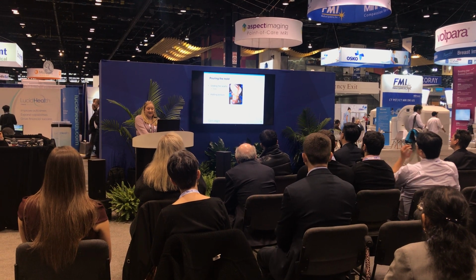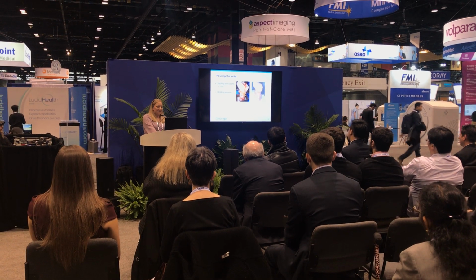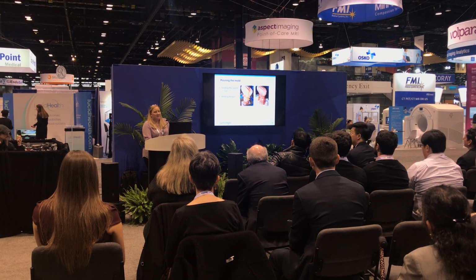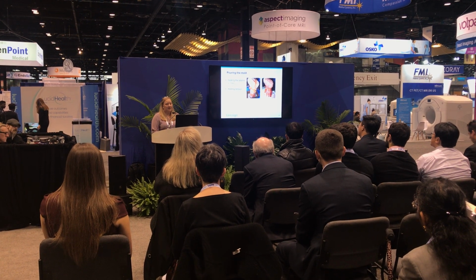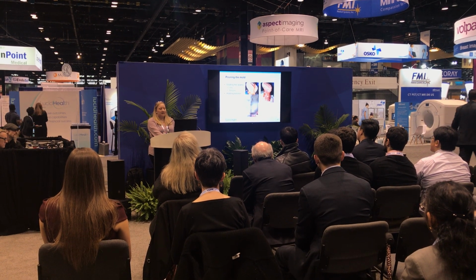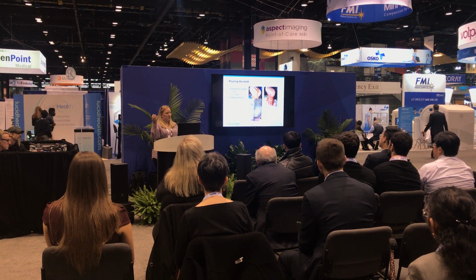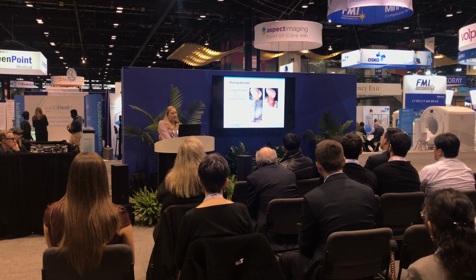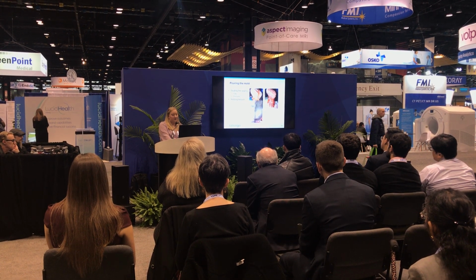So, sealing the seams. We have used clay in the past with success, and unfortunately without success. I was actually out at Mayo and we were talking about this and how frustrating it is. Sometimes it's 100% great and sometimes it's not, and I don't know what we could do different. I was like, I almost wonder if we can use hot glue. And this model is actually completely filled and poured, and I'm just holding it up in the air. I highly recommend it. Definitely stay away from it with FDM, obviously, because it's gonna be warping your mold, but for a binder jet printer, it works great.